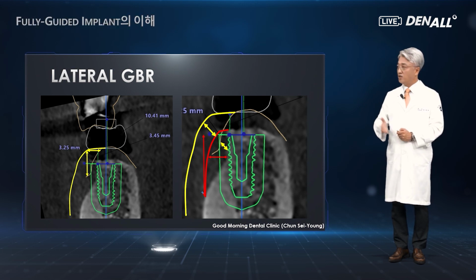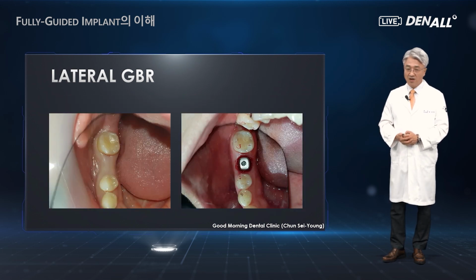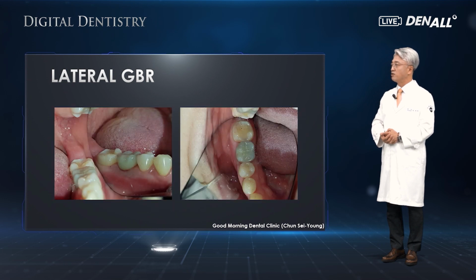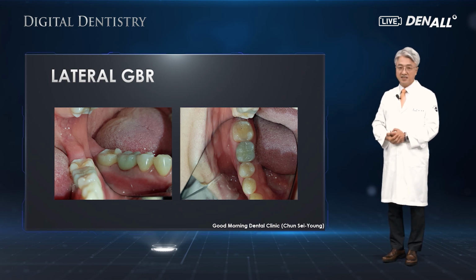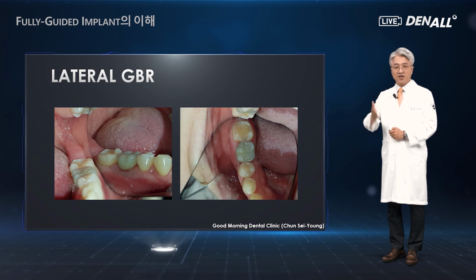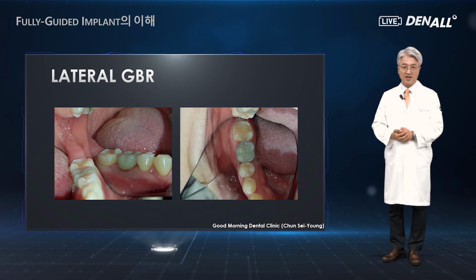At this stage, the diagnosis and the planning have been made. Therefore, bone graft and soft tissue graft was done. This is the contour of definitive prosthesis, naturally flowing with the gingiva like a natural tooth to facilitate the self-cleaning as much as possible. And this is how it is finished. Before surgery, all of these were planned using the implant studio.